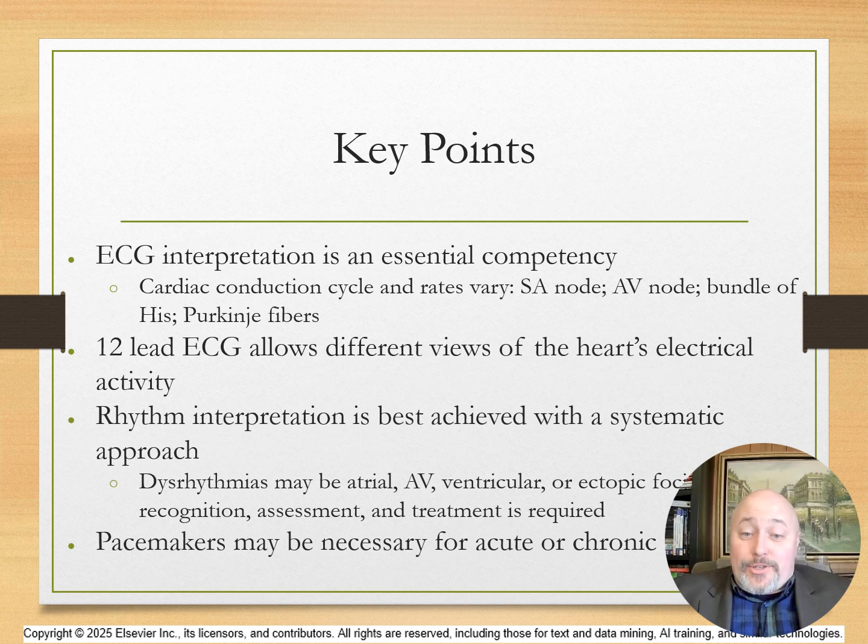EKG is an essential competency, especially if you're on a cardiac floor working in critical care. Being able to read and interpret that ECG is going to be a critical skill. That 12 lead allows different views of the patient's electrical activity, and rhythm interpretation is best achieved with a systematic approach, going slow, and taking it one step at a time. Now, don't let it be overwhelming. What you've got right here is everything you need, the basics, to begin and take that next step and eventually get your own ACLS certification.